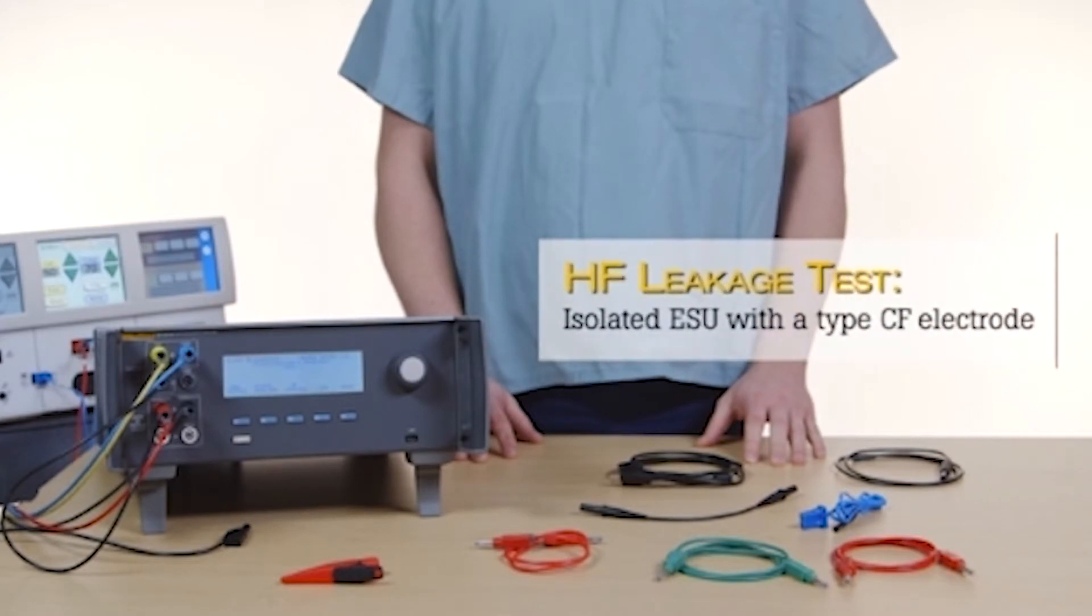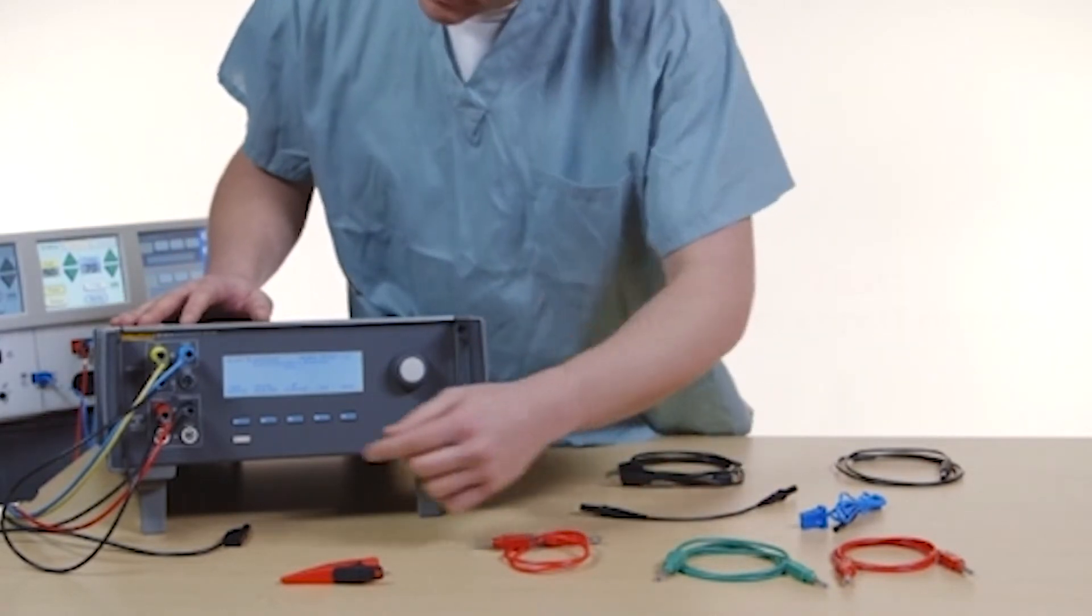Here's how to do an HF leakage test for an isolated ESU with a type CF active to earth electrode.